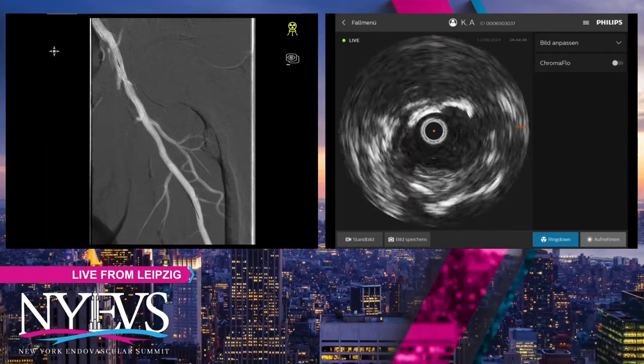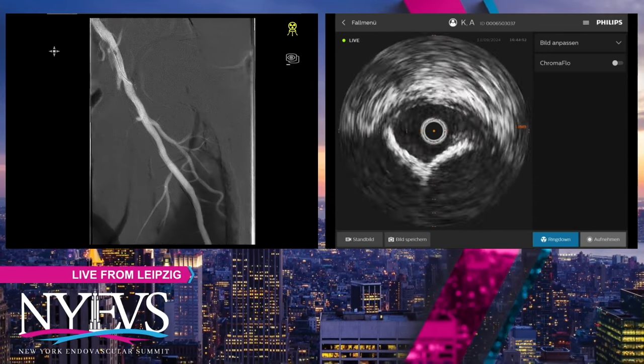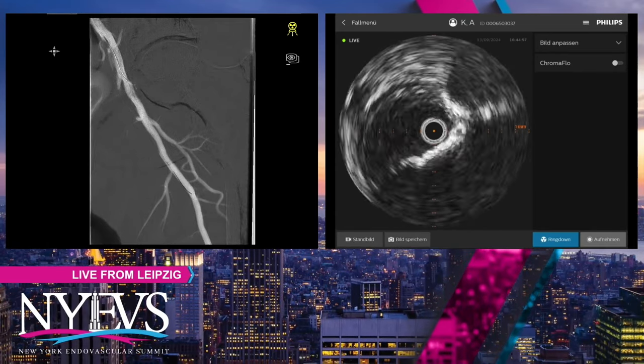Andre, are you able to show us the pre-IVUS by any chance? Is that something you could show us? Sure. Just for our learning and understanding. Okay, just a moment.